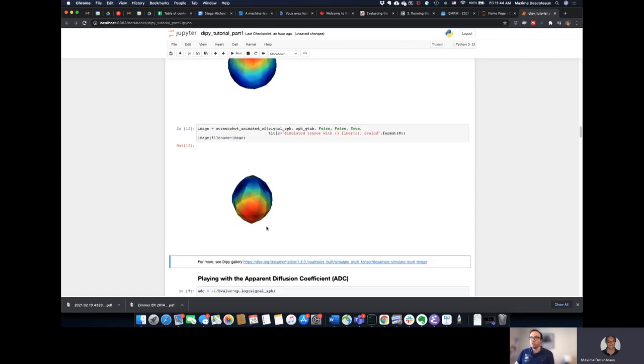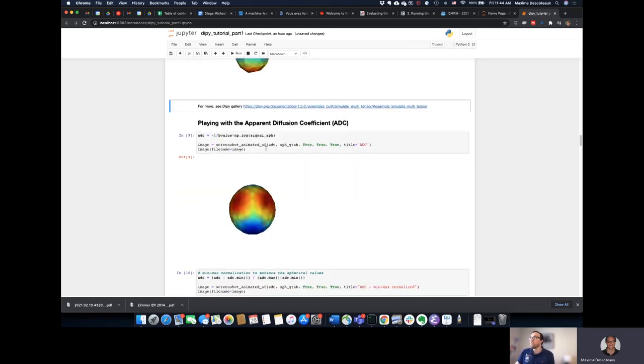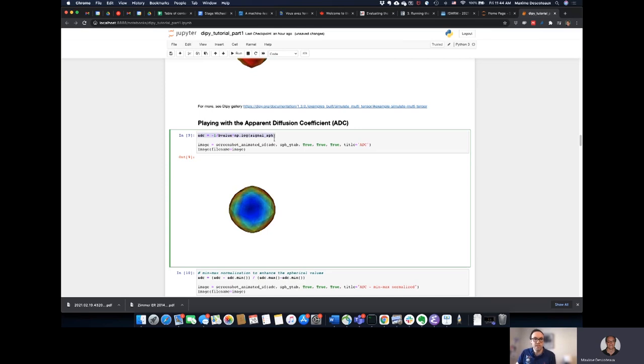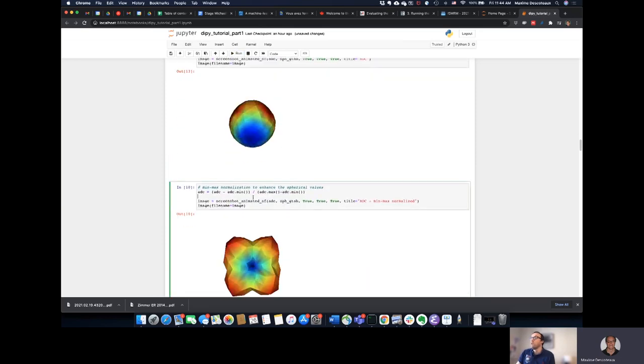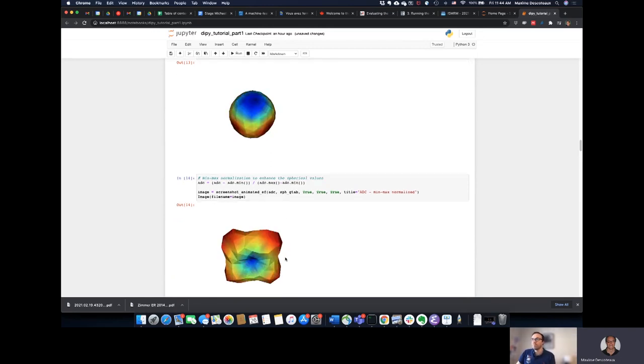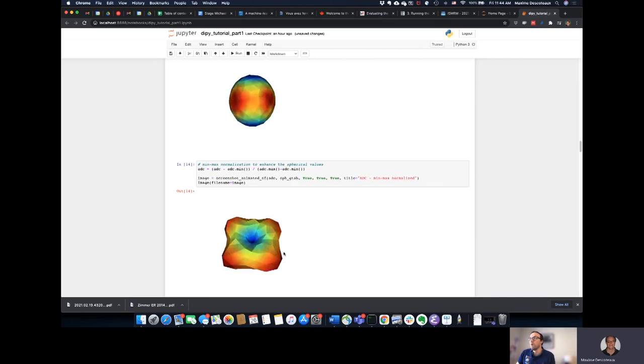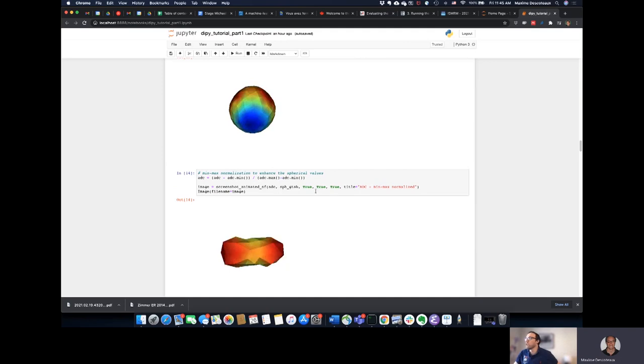So this is a spherical function, values on 64 points of the sphere. Now, if I take the log of this signal, I actually get the ADC. The apparent diffusion coefficient is related by a negative exponential. So just taking the log of the diffusion signal, you get the ADC. And so suddenly the ADC now looks like a crossing fiber object. It turns out to not be properly parameterized to do fiber tracking, but you at least see that this object is a two fiber compartment object. And finally in this little demo, what I want to show you is the spherical harmonics.